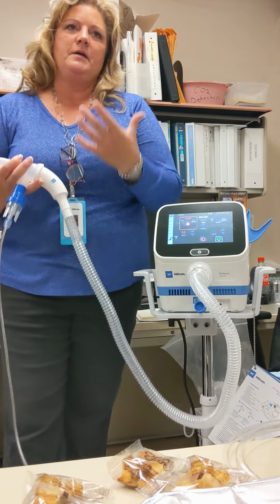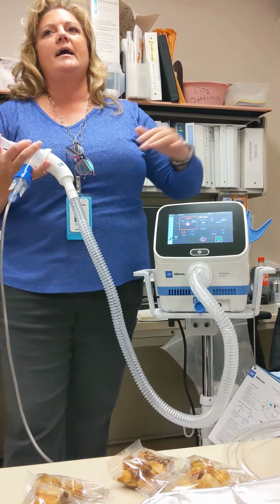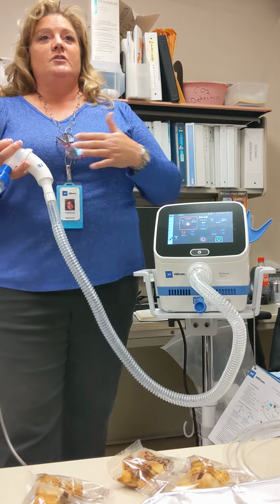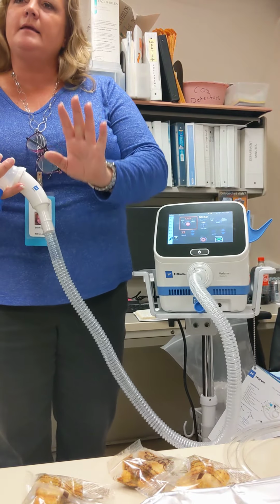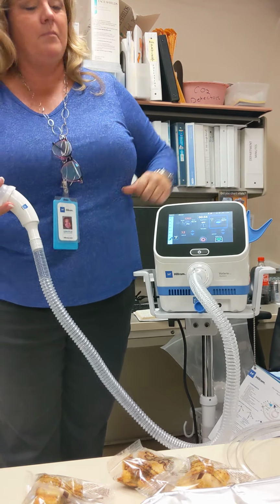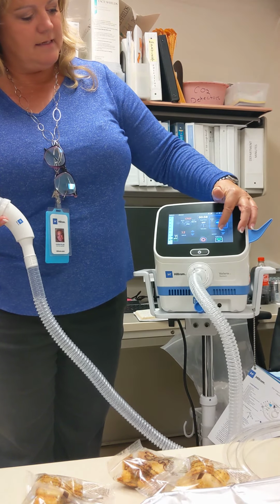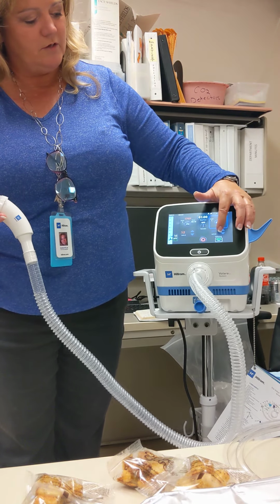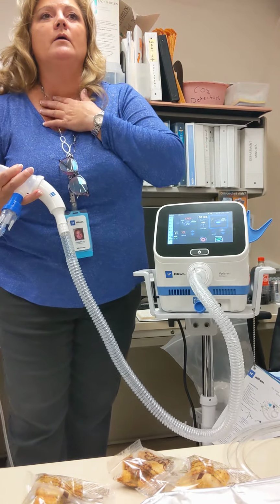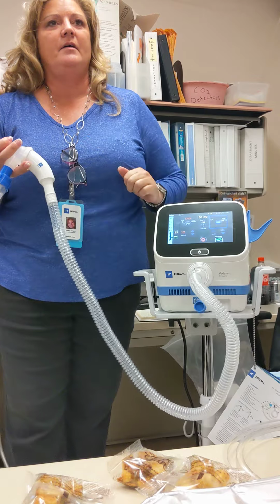Now we talk to the patient. Take big breaths in, out, breathe normal, try and relax. And they're going, oh, I got an air compressor down my throat. You just wait, take it easy. You might only be on this for 15 seconds, then you hop over to oscillation. Let's say you don't see any chest wiggle, now you can turn it up. Oh, now I see chest wiggle. They can feel it.